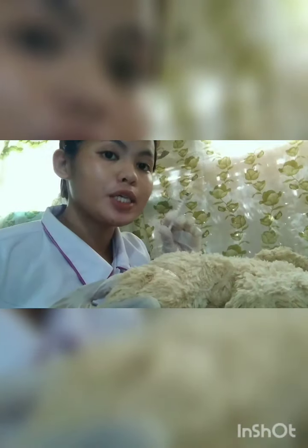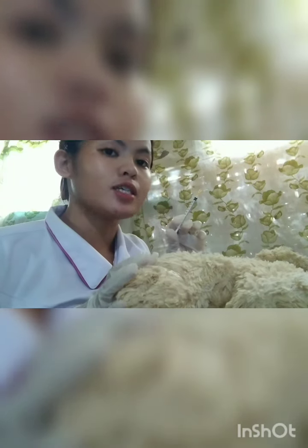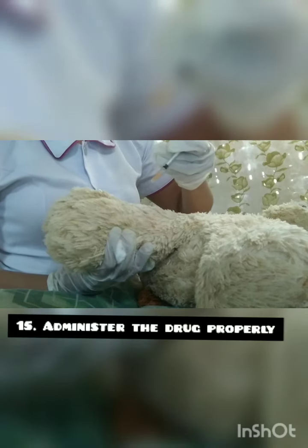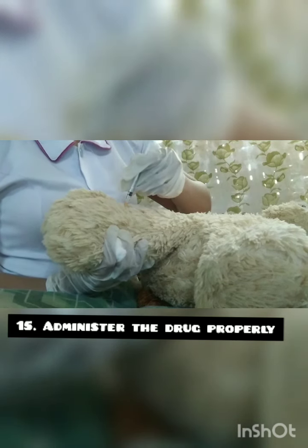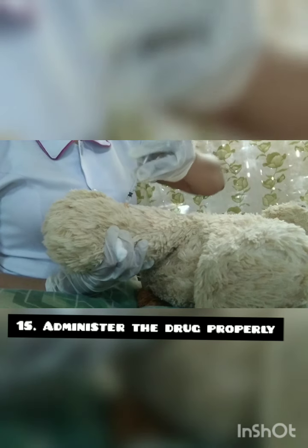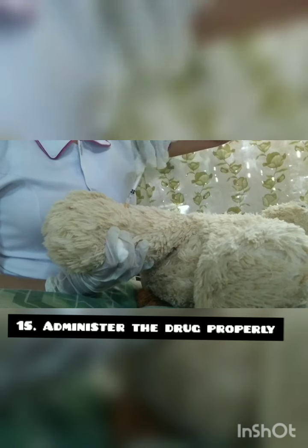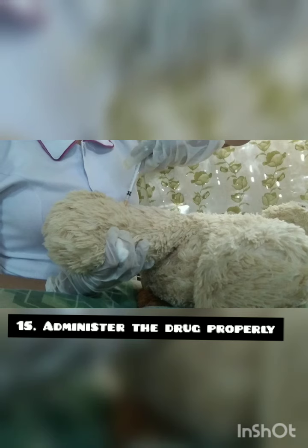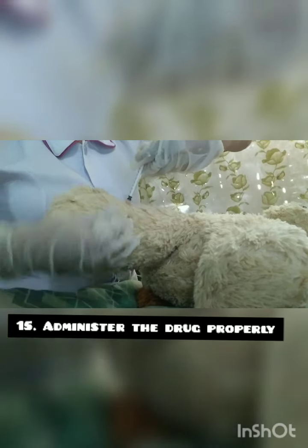Now, I am going to insert 0.1 ml of vitamin K to the left vastus lateralis of the infant. Position the ulnar side of the non-dominant hand just below the site and pull the skin laterally approximately 2.5 to 3.5 cm, and hold the position until medication is injected. With the dominant hand, inject the needle quickly at a 90-degree angle into the muscle. Injection into the correct anatomic site prevents injury to nerves, bone, and blood vessels.